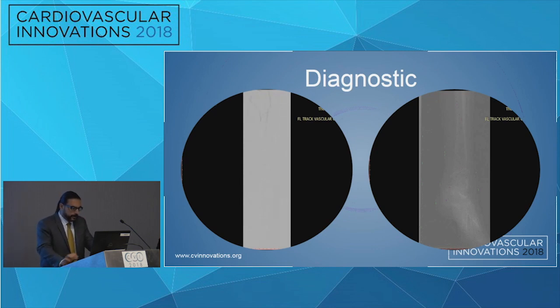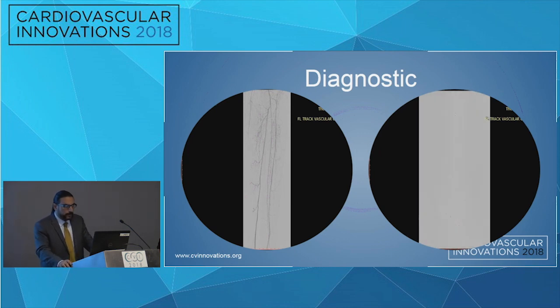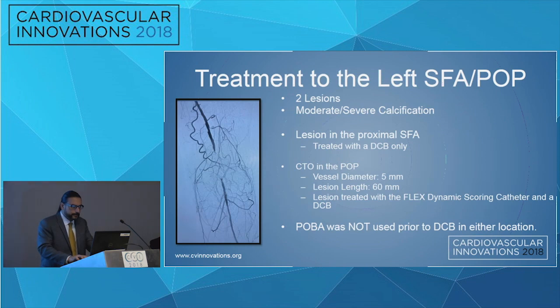Infragenicular vessels appear satisfactory. As you can see, the anterior tibial and PT fill quite nicely. Peroneal reaches the ankle mortise without any concern. There is filling to the plantar vessels of the foot, as you can see over here, and there is a complete plantar arch. Interestingly, despite all that, patient has rest pain. I mean a really low ABI for just a short segment chronic total occlusion of the distal pop.